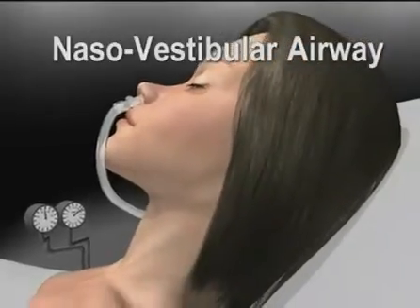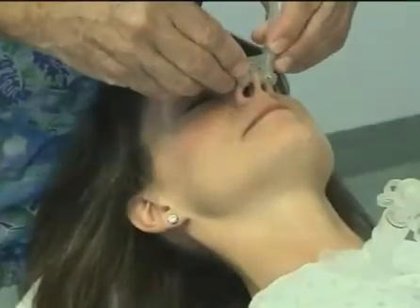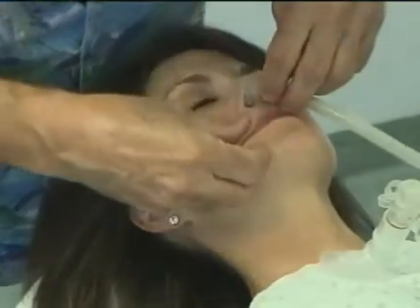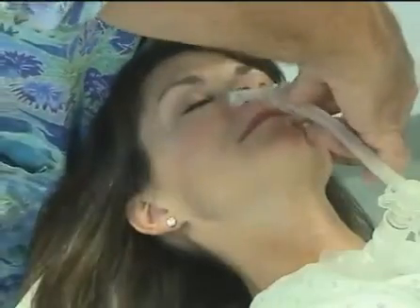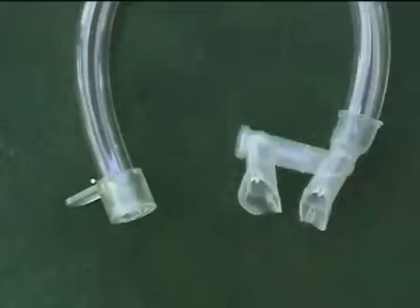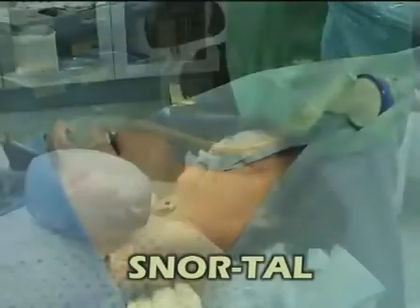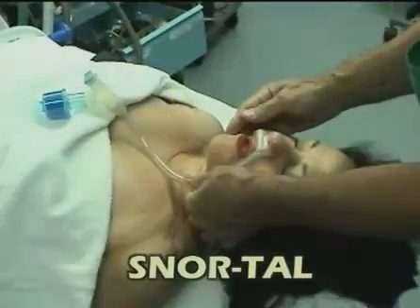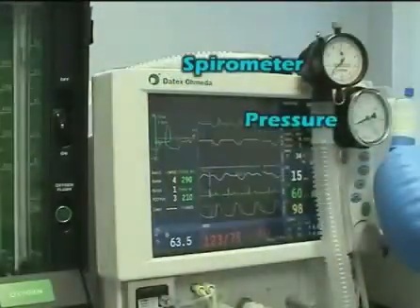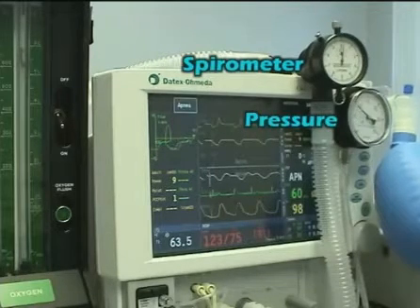The nasovestibular airway, or NVA, is an interface device which seals to the nose of the patient and connects to ventilator tubing for the purpose of delivering nasal CPAP. It is especially indicated in facial surgery where it is self-retaining, requires no straps or tape, and is unobtrusive in the surgical field. The SNORTAL, the SNOR tracking and assist linkage, configures the NVA with a non-vented connection to a standard anesthesia circuit and facilitates the precise monitoring and control of airway pressure, flow rate, and oxygen concentration.